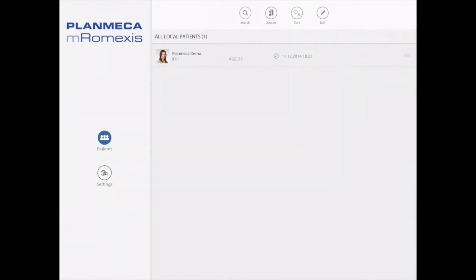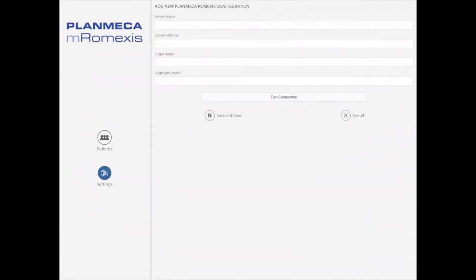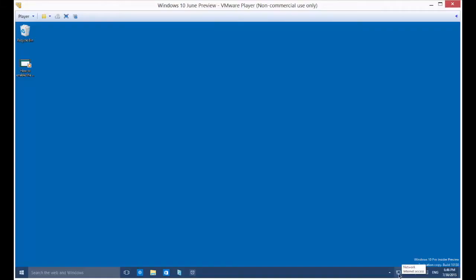Hello, Brent Garvin with Planmeca here to share with you how to set up mRomexis for your iPad or your Android tablet. So we need to go to settings on the first screen here and we're going to add new server at the top, and we're going to need to get the server IP address.